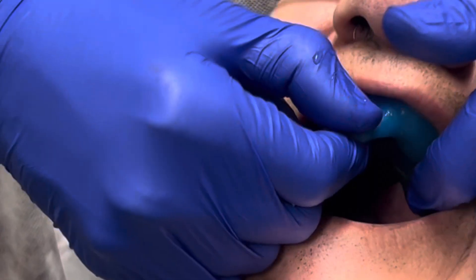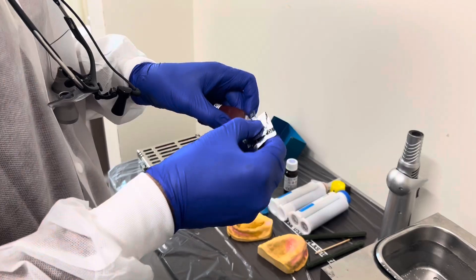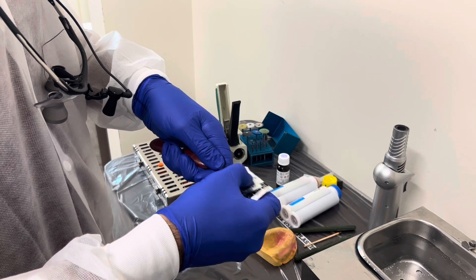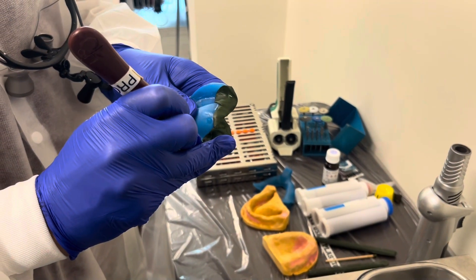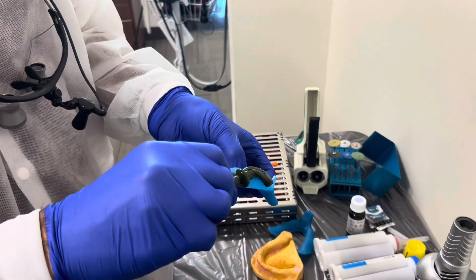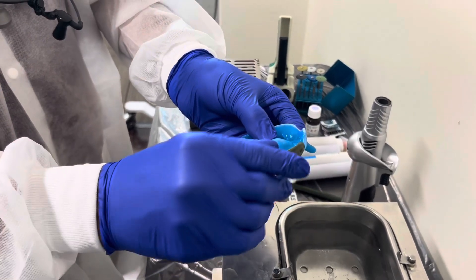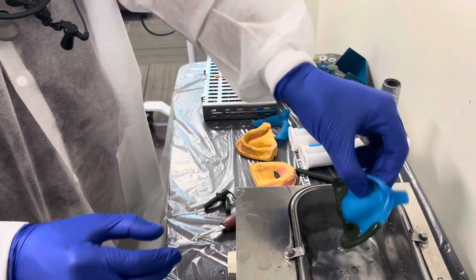After we take it out, we notice a little bit of excess. We can slice that off using a number 25 blade — we'll put it onto our blade handle and just slice it off while it's still warm. We're going to go ahead and heat up another piece of green stick compound and apply it onto the distal buccal area of the tray, molding it so that it sticks up a little higher than expected so that it would be adequately border molded.